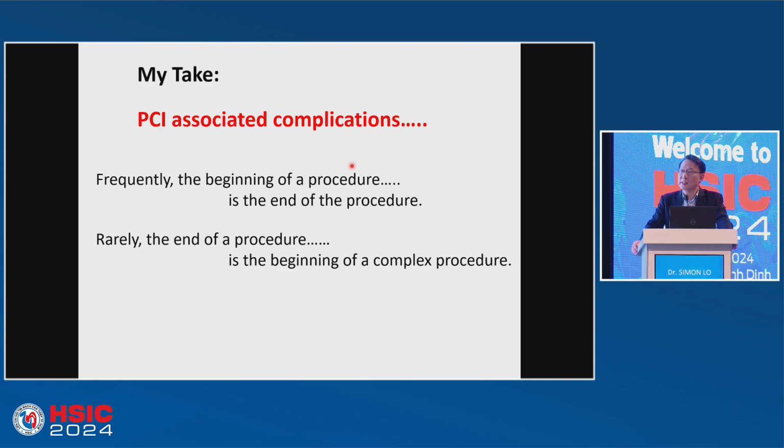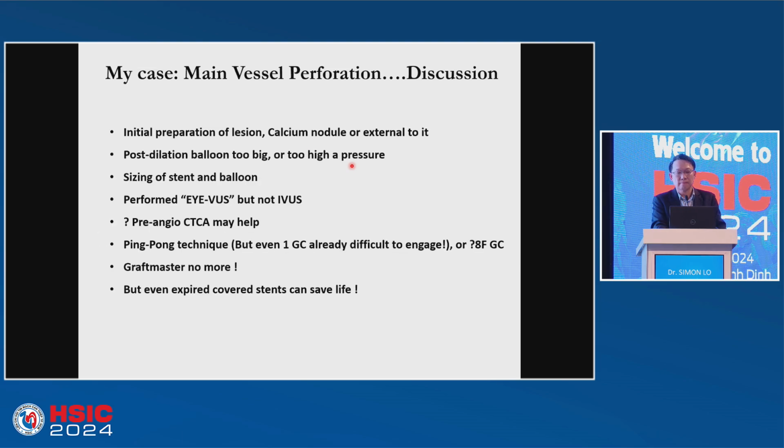So, my take on these PCI-associated complications. Most frequently, the beginning of the procedure is also the end of the procedure. Extremely rarely, we hope rarely, the end of the procedure is the beginning of a very complex procedure. And this case illustrates this definition of what I meant by PCI-associated complications. So, just for discussion's sake, I look back on this case. I will never forget such a case, okay?